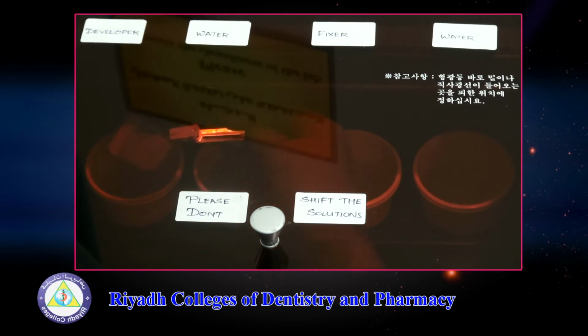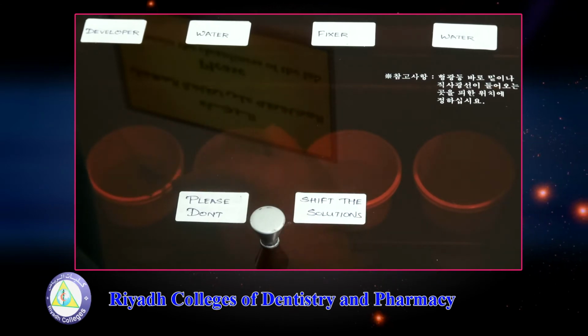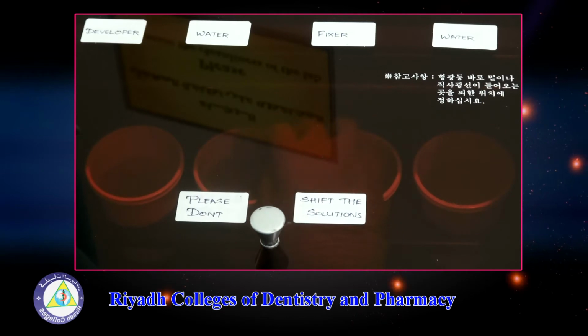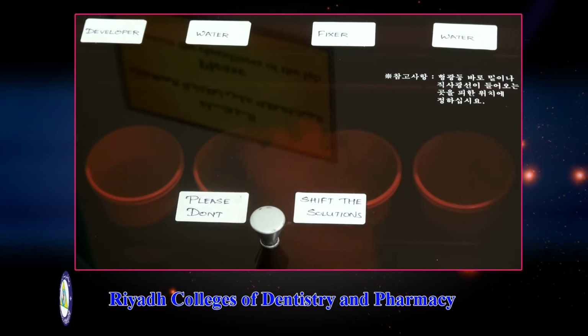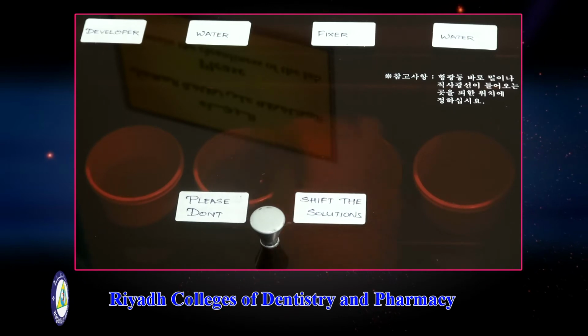So once you see these structures and the color codes, you have to put the film in the water for rinsing. That is your second step.